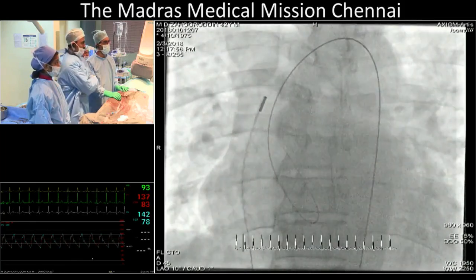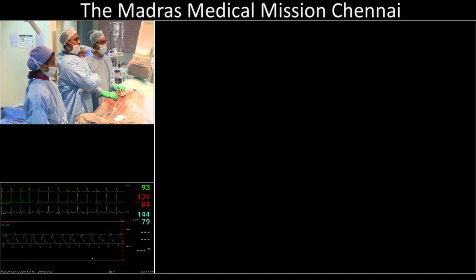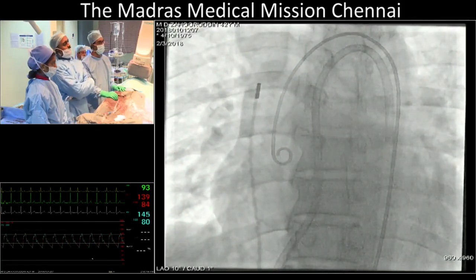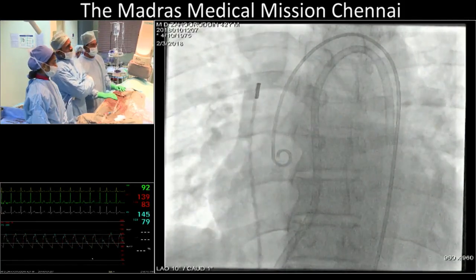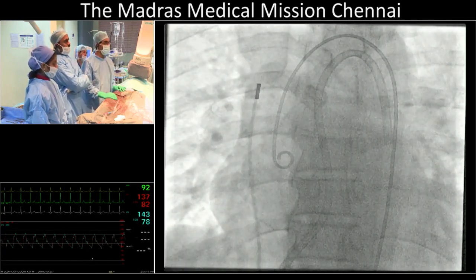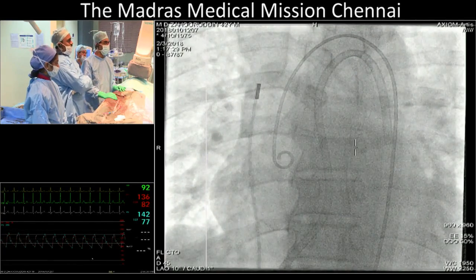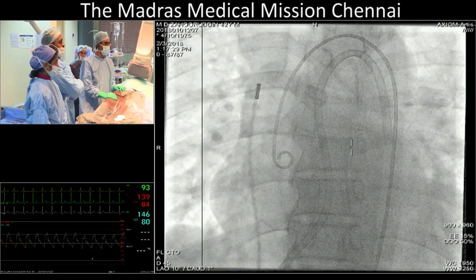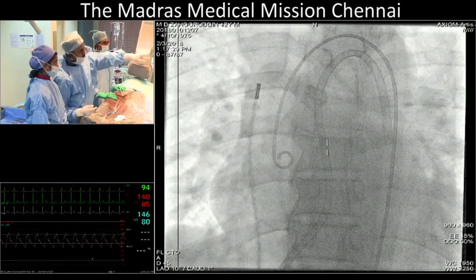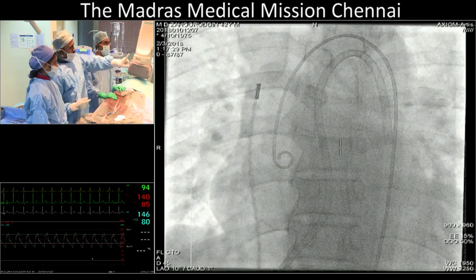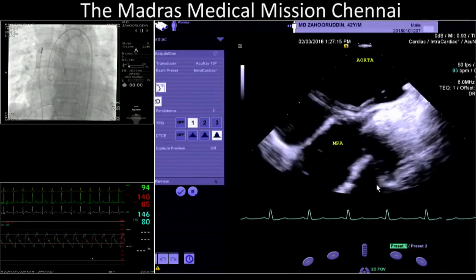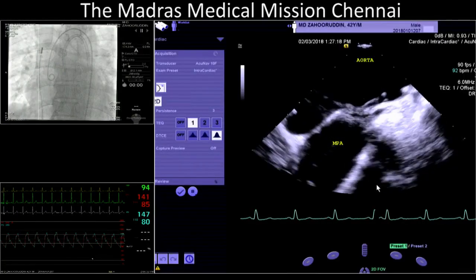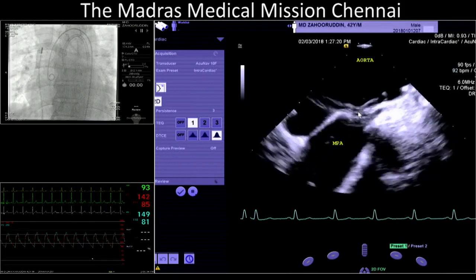We got the regular arteriovenous circuit. What we have now is, through the AP window, a venous sheath from the main pulmonary artery going into the descending thoracic aorta. On intracardiac echo we are seeing the sheath passing through the AP window into the ascending aorta.